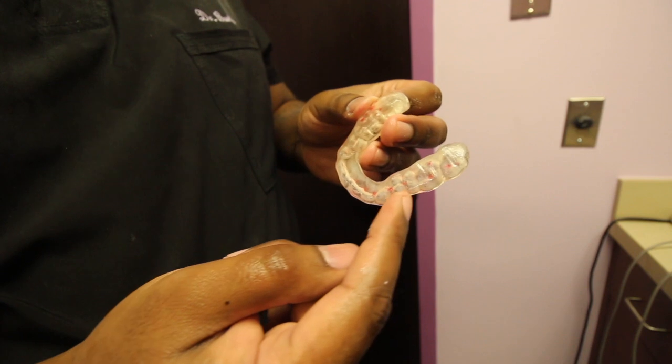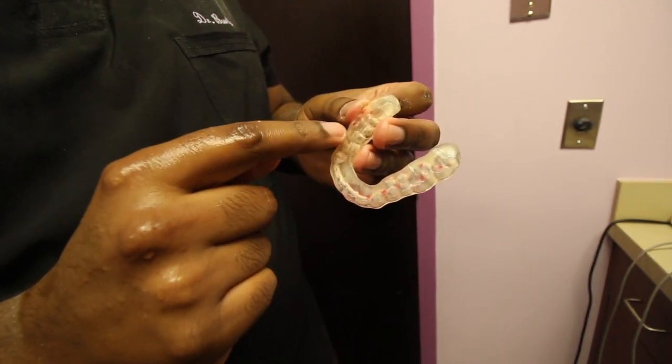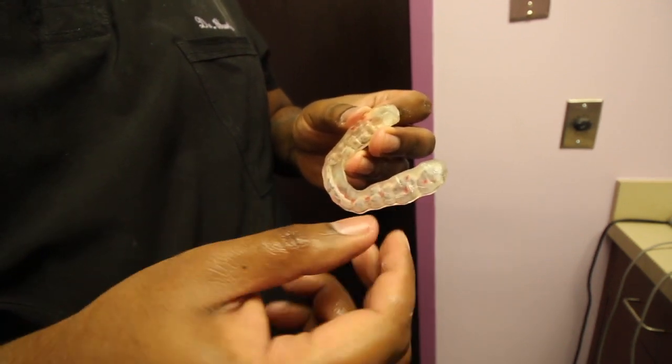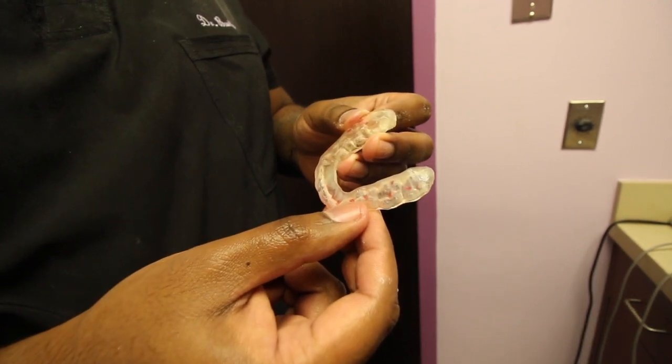So now you see so many marks. We're going to do it one more time to get more marks right there, and then we're going to lighten the marks in the front. You want heavier marks in the back. And then the patient can wear this for 1 week, and then we'll see him back for adjustments.